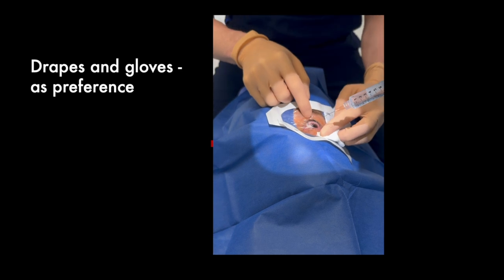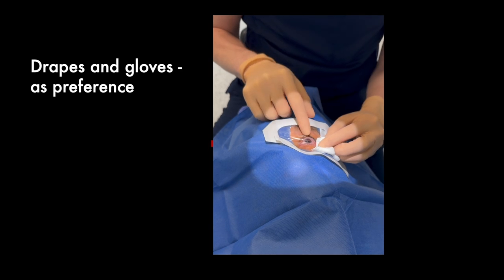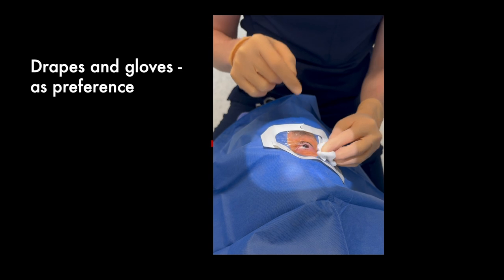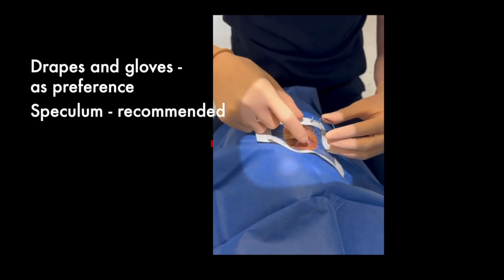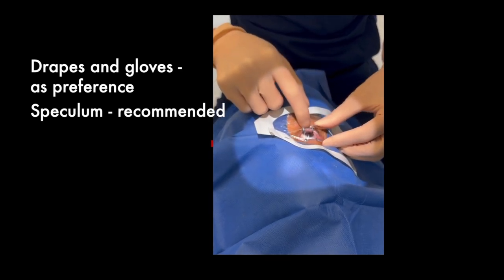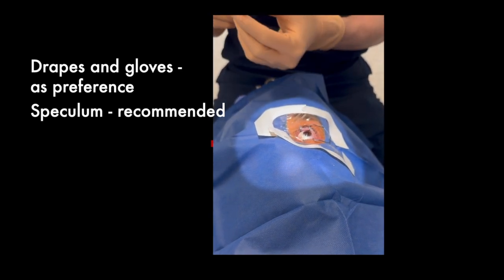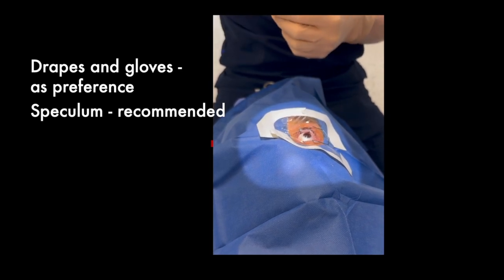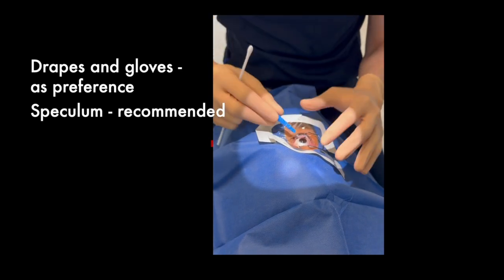By this moment, the patient has already been cleaned in the periocular region with 10% povidone and also received 1 drop of 5% povidone at least 5 minutes before. And of course, at this point, anesthesia has been applied. The speculum is recommended because it helps isolate or divert the eyelashes from the puncture site, although it is often considered uncomfortable for the patient. Believe me, many patients complain more about the application of the speculum than about the injection itself. So if you want to remove it or not use it, it's okay as long as you take care of not putting the eyelashes in the puncture site.